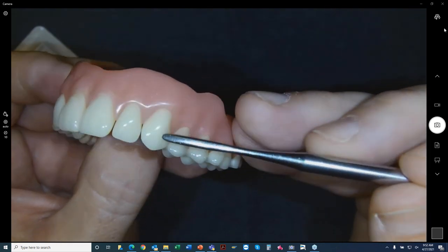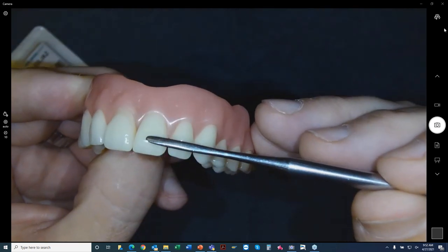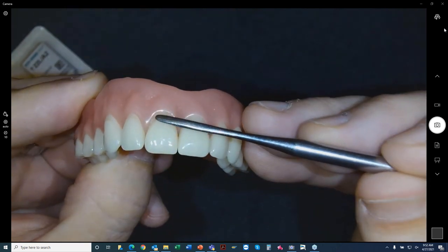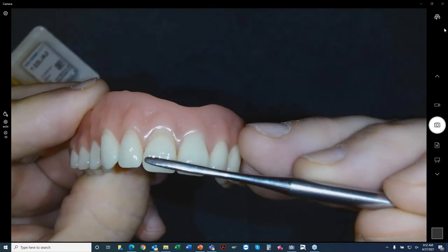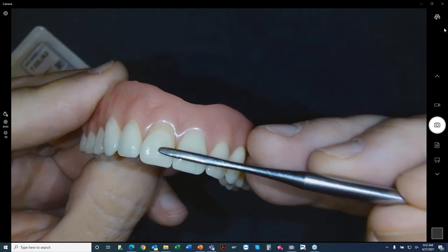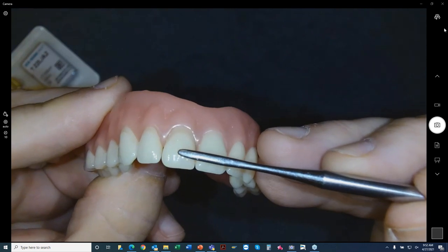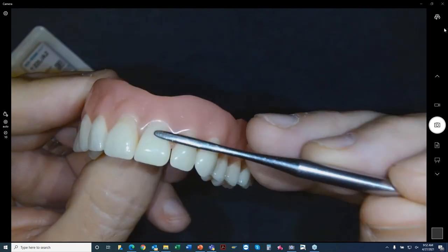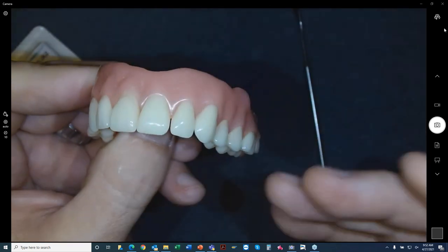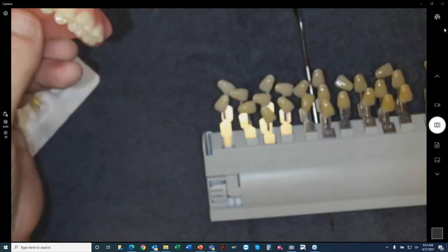We all know that. We stay away from polishing denture teeth, don't we? We get in trouble when we accidentally go and polish these teeth. But there are sometimes some patients, even though you might take a risk and say, hey, doctor, I'm going to get you a nice, useful tooth look for your patient. And they may say, hey, it's a little bit more texture. It looks a little too youthful. Well, again, just go ahead and polish these off. These are nicely polished. This is just pumice, standard polishing procedure. So you can take care of that as well.